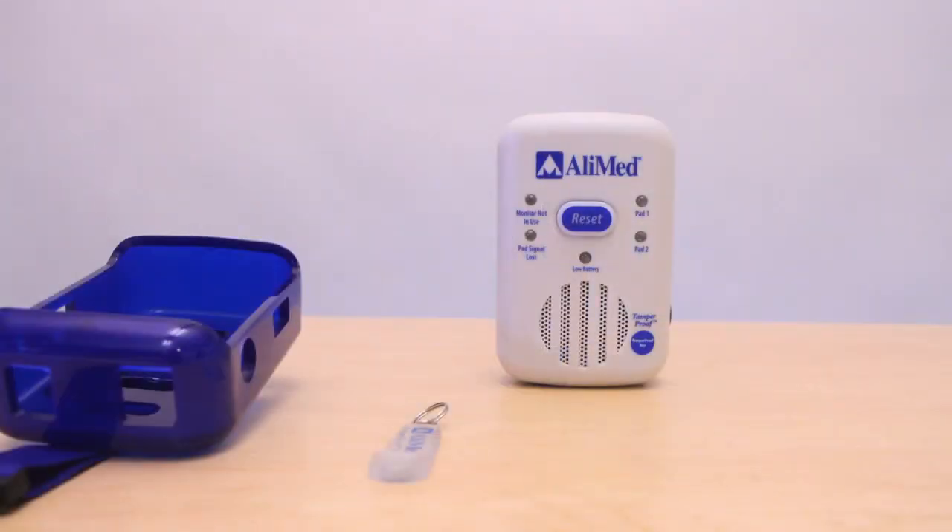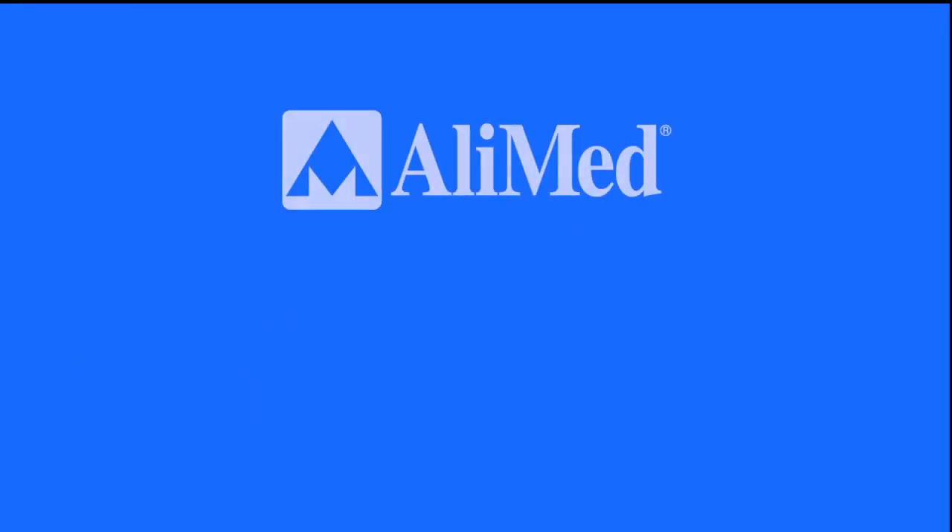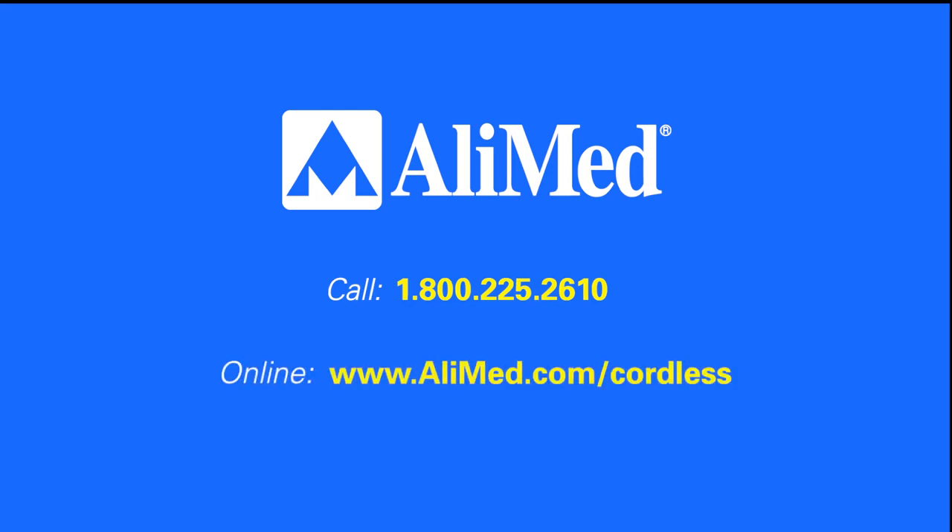Like all Alimed alarm systems, the cordless sensor alarm delivers reliable alerts to help reduce incidents of falls and injuries. This is not intended to serve as a replacement for the instructions for use included with the product. To request more information, call 1-800-225-2610 or visit us online. For our complete line of LTC and acute products, shop online or order a free catalog.